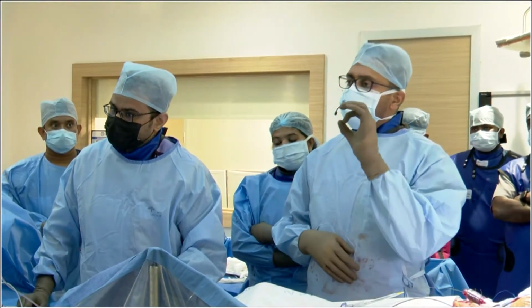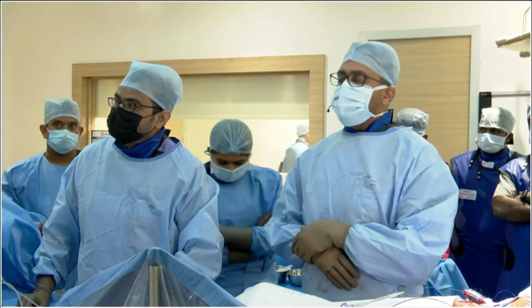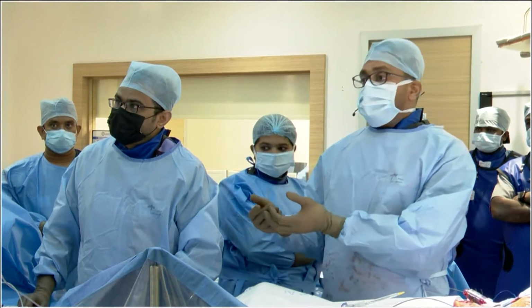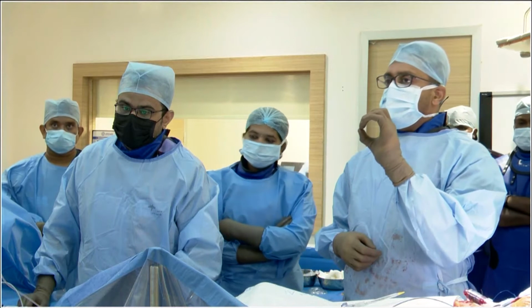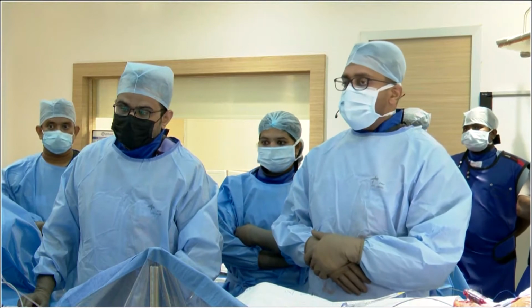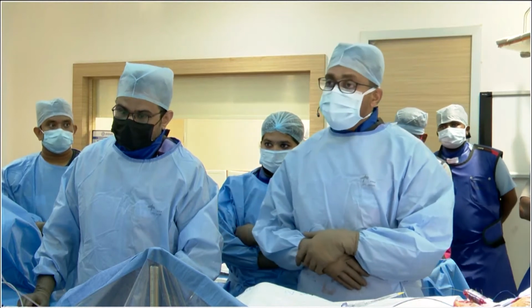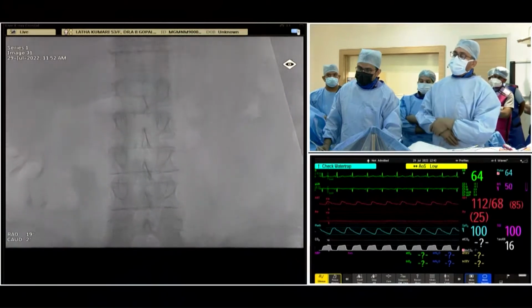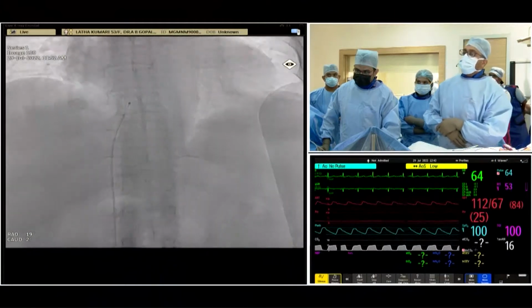And the reason for that is I like a very circular orifice. I think increasingly we're going into TAVR in TAVR. And therefore, if one wants to minimize target valve revalving, I would call it TVRs, then achieving a perfect circular structure is very important, I think. And for that, you need good radial strength, especially with bicuspids. So personally, I always go with a balloon expandable anywhere I want radial strength and I really feel that I can get a better circular structure and absolutely no gradients from a TAVR procedure. So that's why I'm choosing a balloon expandable.